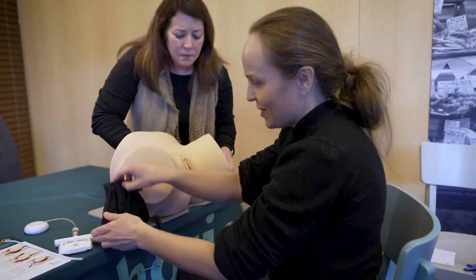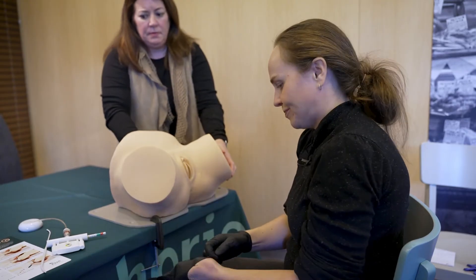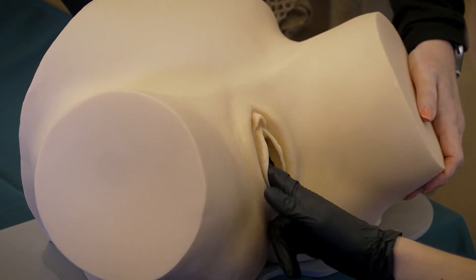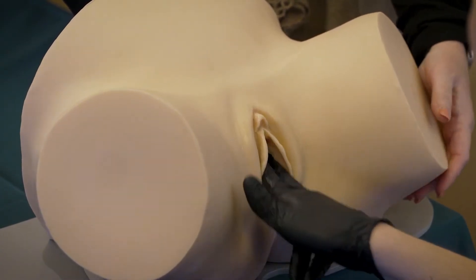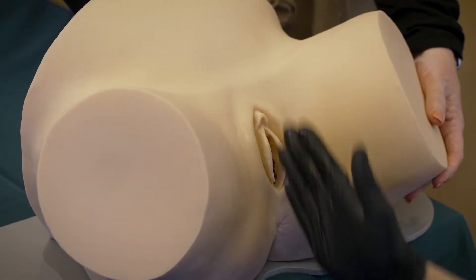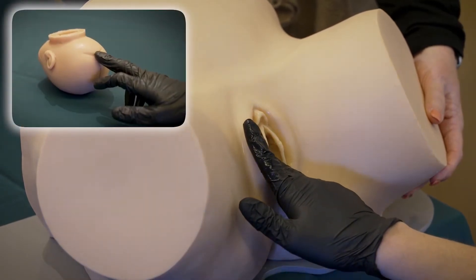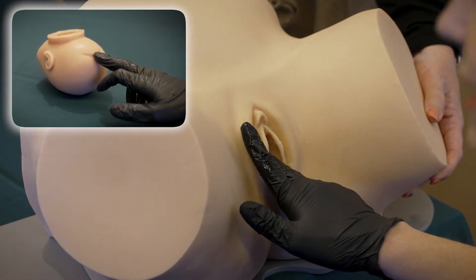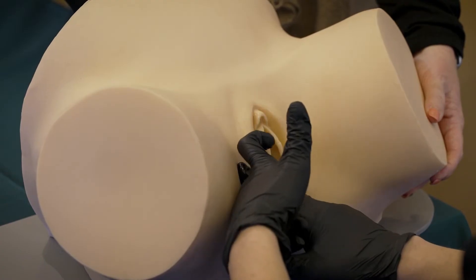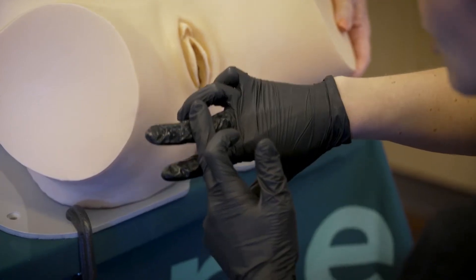Now we'll go through the five-step technique for a kiwi vacuum assisted delivery. Step one: locate the flexion point and calculate the cup insertion distance. The cervix is fully dilated with some moulding. I can feel the posterior fontanelle at 12 o'clock with the sagittal suture running through the maternal midline. Place your middle finger on the posterior fontanelle and estimate three centimeters along the sagittal suture to reach the flexion point. With your finger on the flexion point, use your opposite hand to mark where the finger exits the introitus — for me that's five centimeters. That is the cup insertion distance.